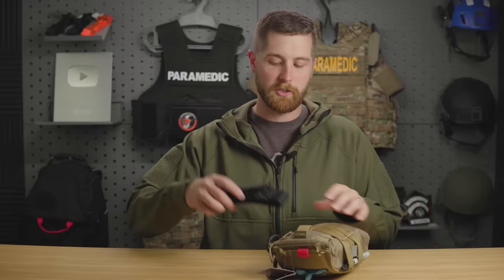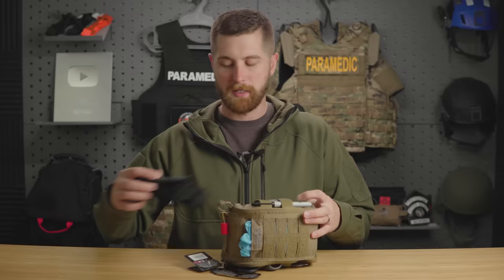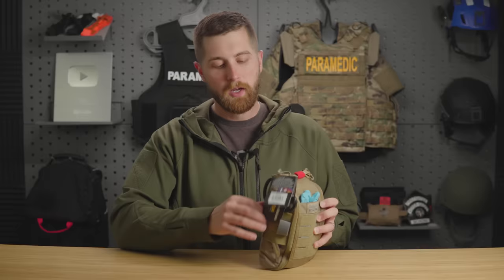And on the side, you've got these two elastic bands. It just fits into, that's not going anywhere. You also have a Sharpie right there as well. On the other side, you have trauma shears. So this is a pretty cheap run-of-the-mill pair of trauma shears.